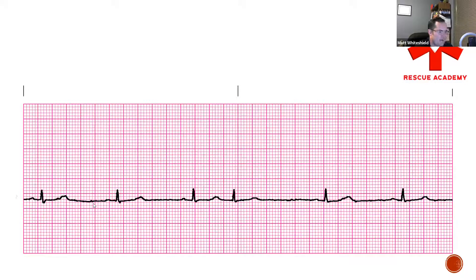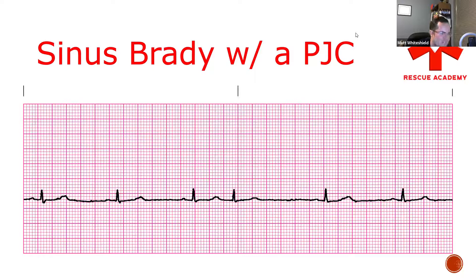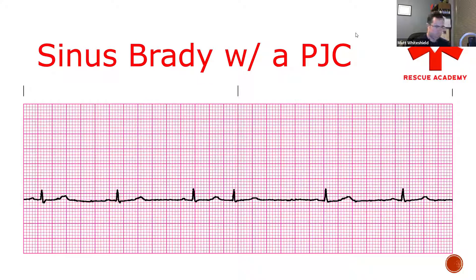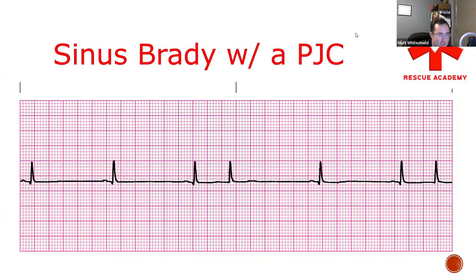What do we got there? Looks like normal sinus, almost even a wandering atrial pacemaker. But we got something happening in the middle of this EKG — we know it's a PJC. The reason why I know this is a PJC is because it's narrow and complex on the QRS and there is no P-wave. Had to show you two different ones. The only reason why this is not junctional escape with PJCs is because there are upright P-waves in both of them — I see an upright P-wave here and here. There are P-waves in this rhythm, which makes it sinus.